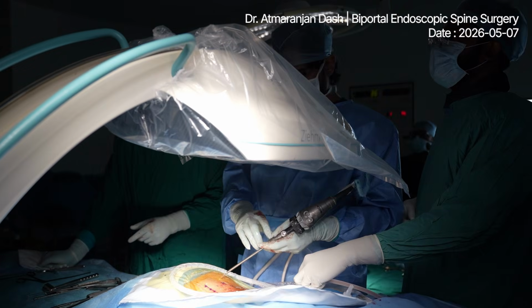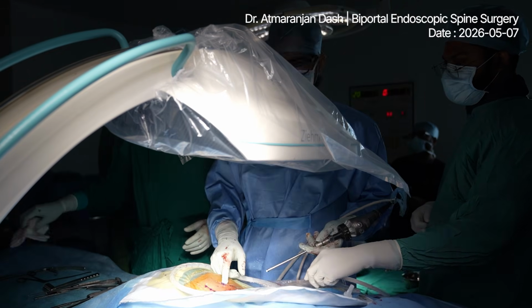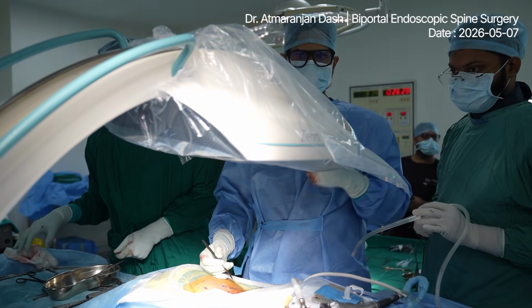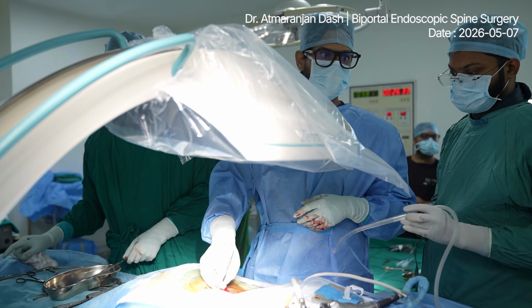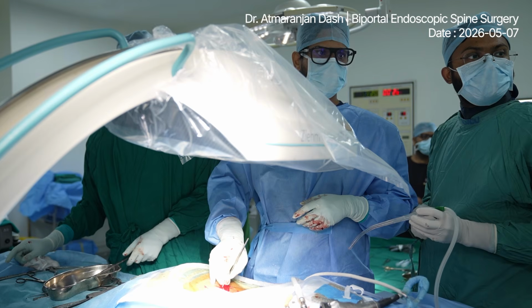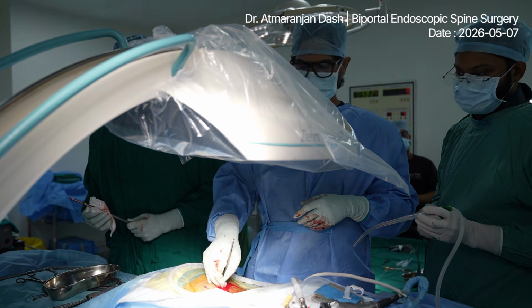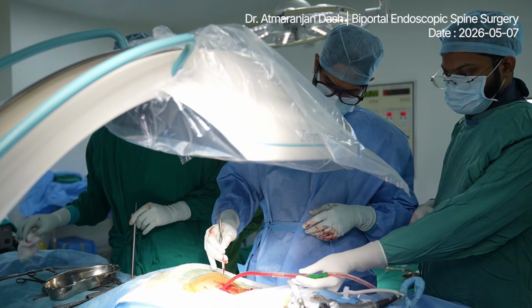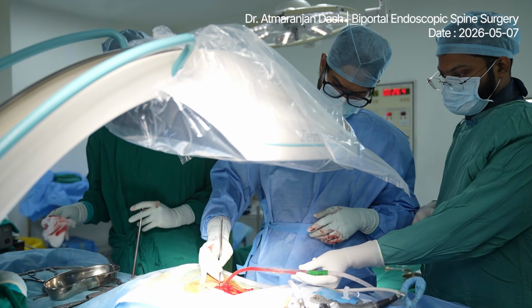Okay. Yes. So now we are complete with the procedure of foraminotomy of this level. So now we are going to start. We are operating on the next level, which is L5S1. Level and another incision down, just to identify.